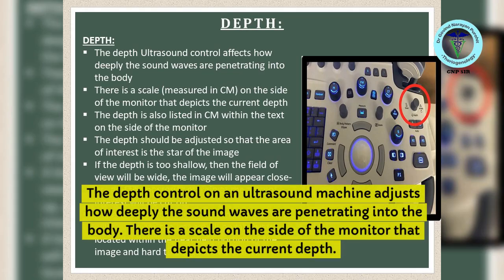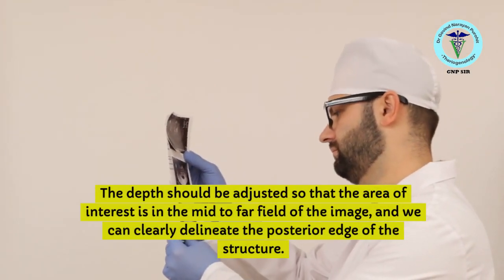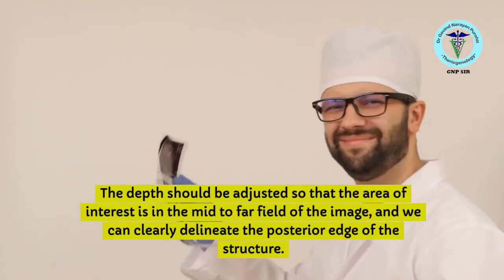The depth control on an ultrasound machine adjusts how deeply the sound waves are penetrating into the body. There is a scale on the side of the monitor that depicts the current depth. The depth should be adjusted so that the area of interest is in the mid to far field of the image, and we can clearly delineate the posterior edge of the structure.